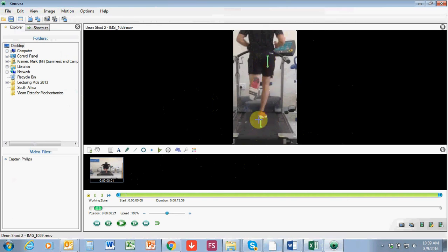and how his heel will recover during the swing phase. Does it rotate out to the side laterally, or does it rotate medially as he's trying to go through his swing phase? So you can already see here that there's some slight hip shift relative to where the heel strikes. So his hip is a little bit lateral, which most likely indicates some hip stability issues, right? Because for good efficiency, these should be optimally aligned. So now if I simply scroll the mouse forward, I'm going to go to where he's in mid-swing and as the opposite leg tends to strike.